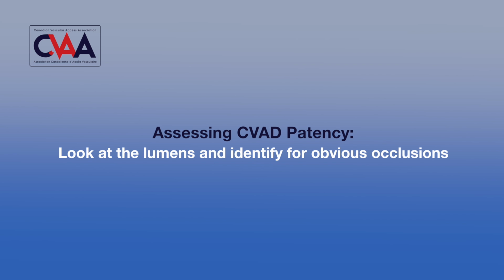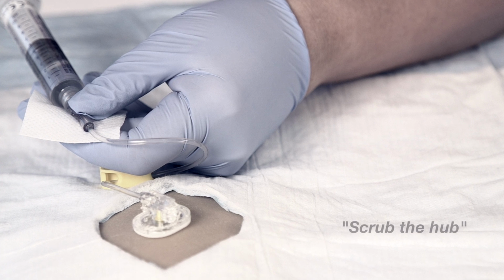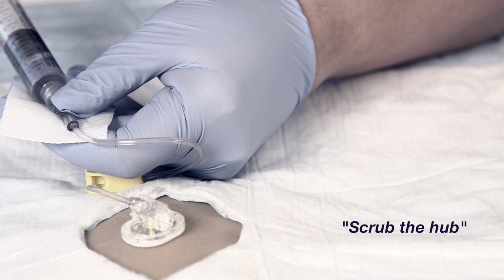We are going to assess for CVAD patency after you look at the lumens and identify if there's any obvious occlusion in the extension set or the needleless connector. We're going to scrub the top of either the needleless connector or the open lumen hub.